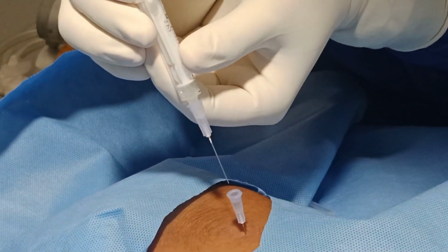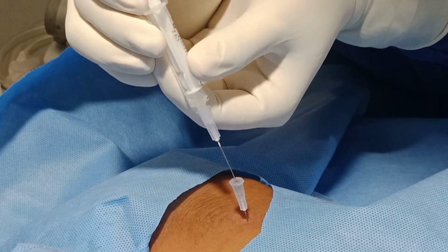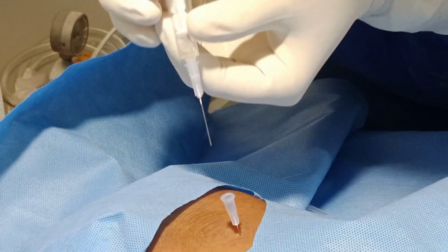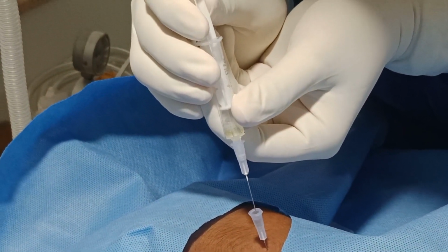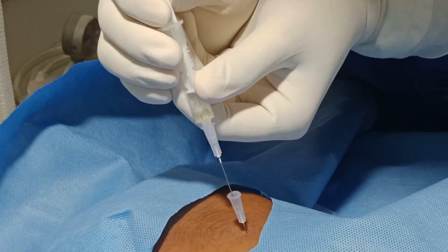All the sterile precautions have been taken, and see, this doesn't require much work for both the doctor and the nurse. The nurse is comfortably holding the baby, and it is a clear fluid, and you can even see the force with which it is coming.